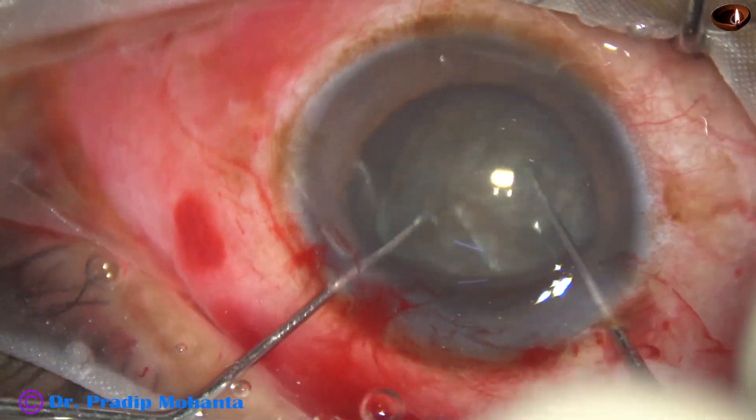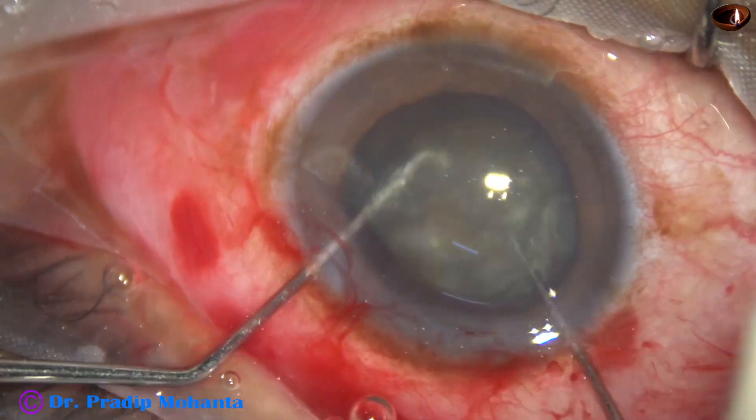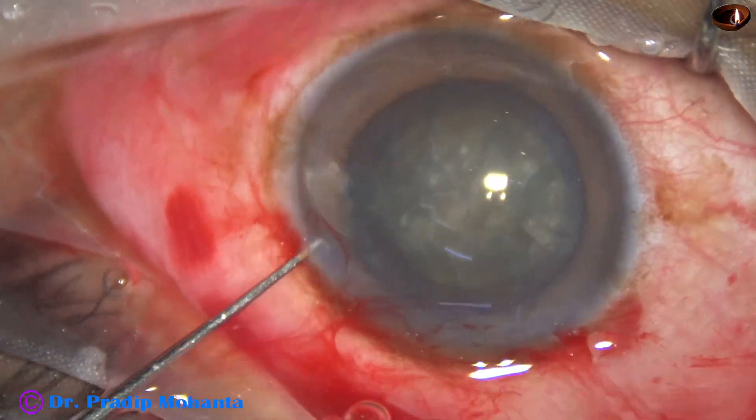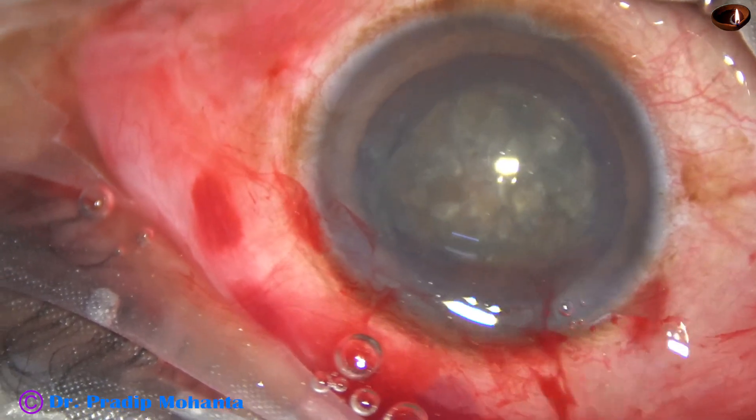Rotation with two hooks is fine — it is zonule-friendly. Both clockwise and anticlockwise, the nucleus has been rotated several times.